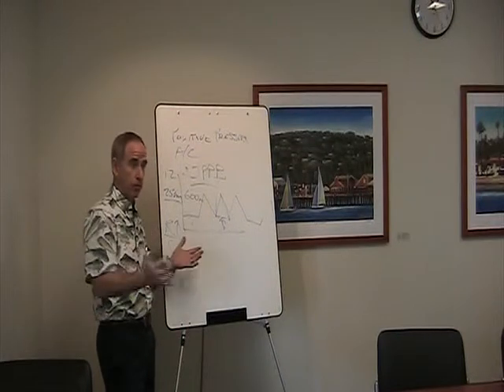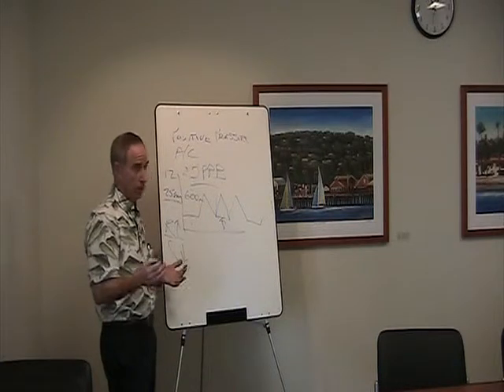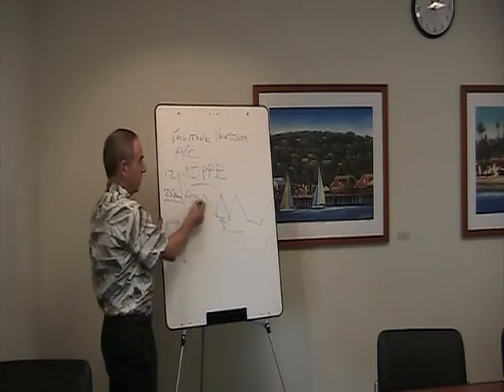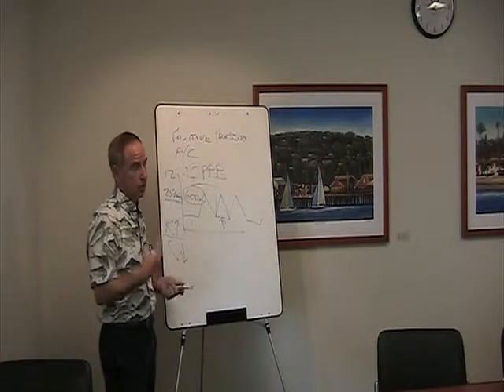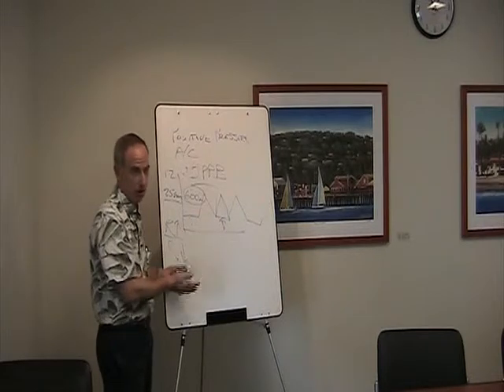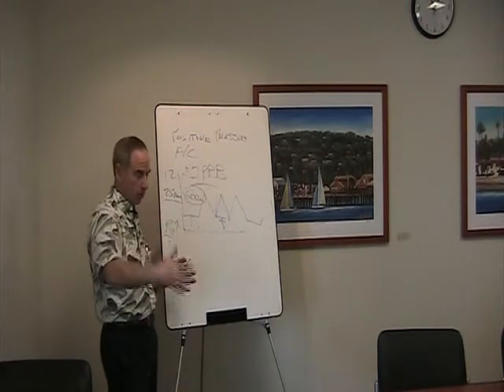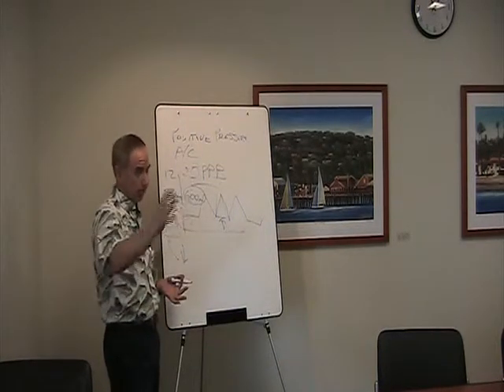So these patients would come over from the emergency room intubated for whatever their underlying cause was. And you would say to the respiratory therapist, okay, I want a rate of 12, and I don't want a pressure, I want a volume. I want a volume of 600 milliliters, a rate of 12, and an FiO2 of 100%. So what would the therapist do? Well, there's no volume setting on this machine because it's a pressure cycled ventilator. So they would tweak the pressure knob, get a plastic bag, and measure the expiratory volume that the pressure would generate.